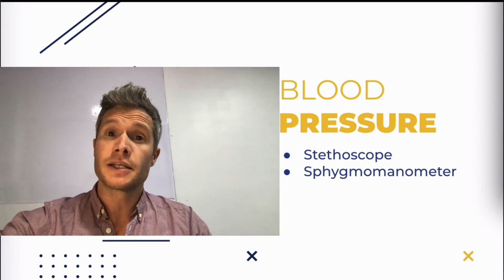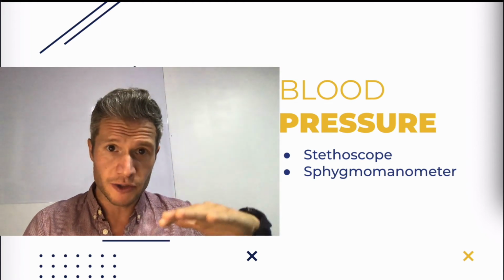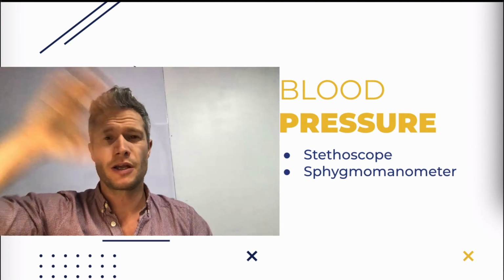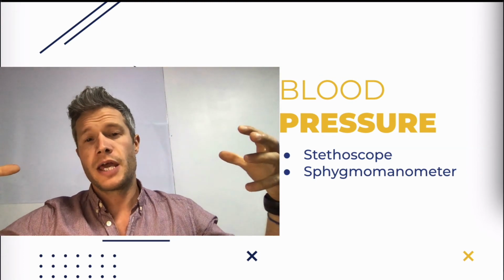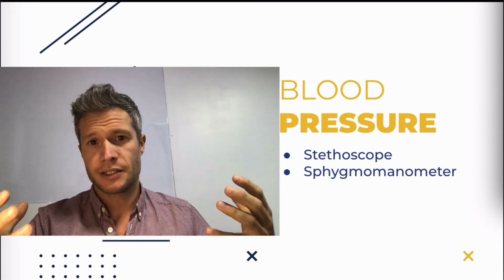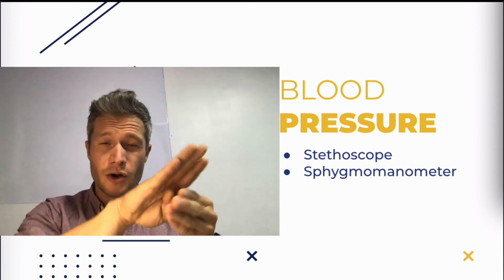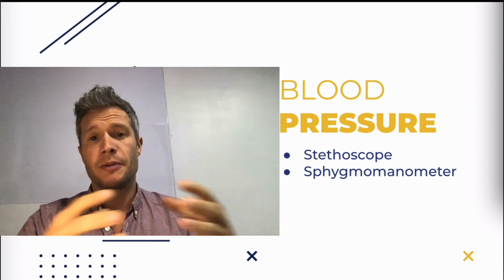On the other end, we're also going to be able to get the number for when your blood pressure is lowest. So the heart contracts, boom, big blood ejection out from the heart. Then the heart relaxes. As the heart relaxes, it relaxes the pressure on the blood in your arteries by becoming larger.